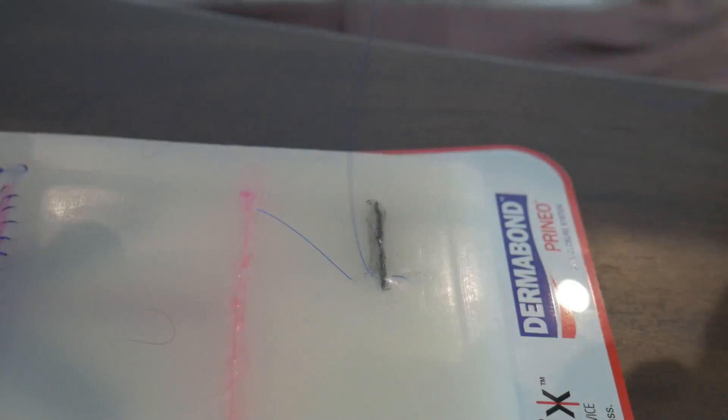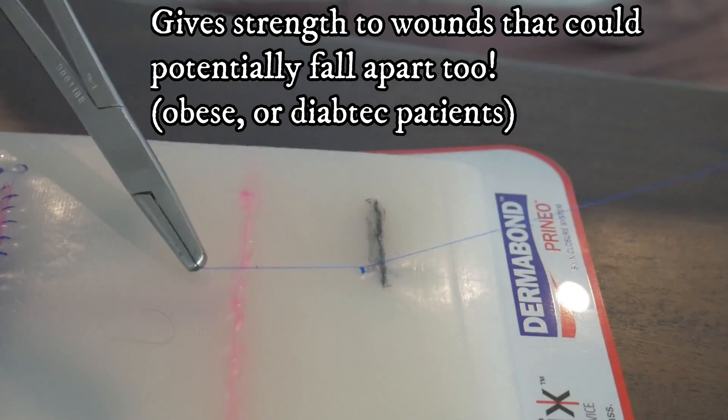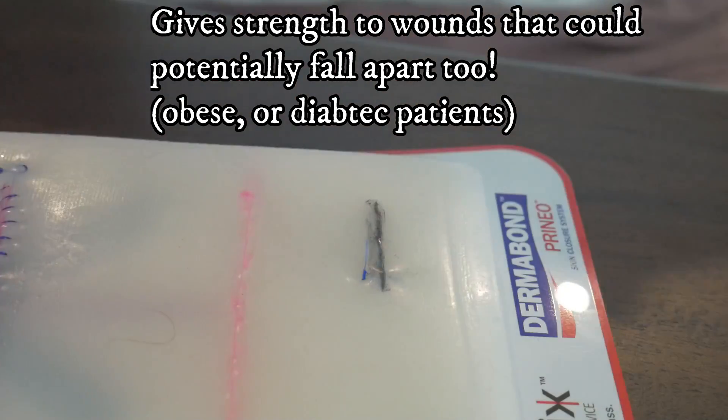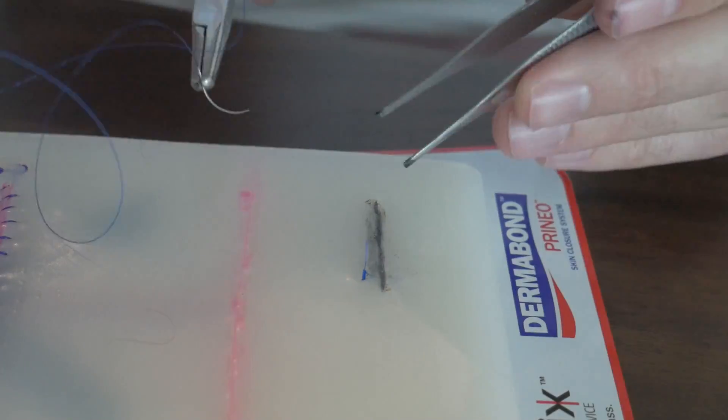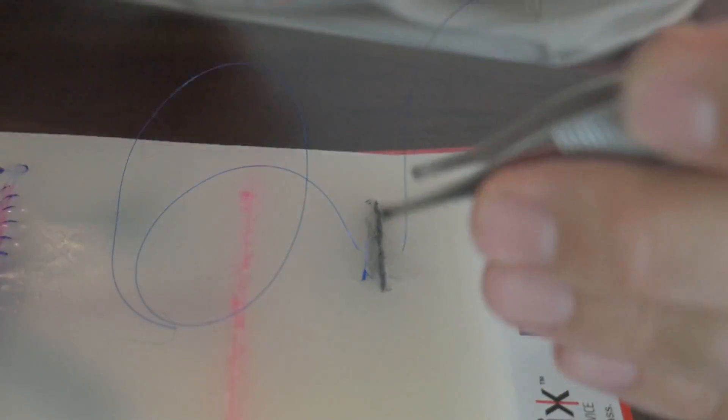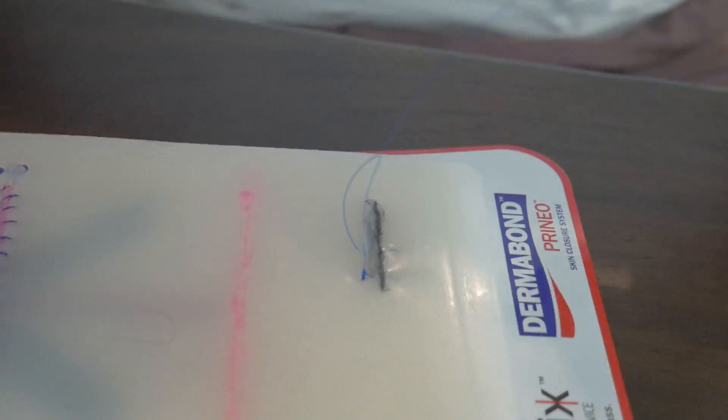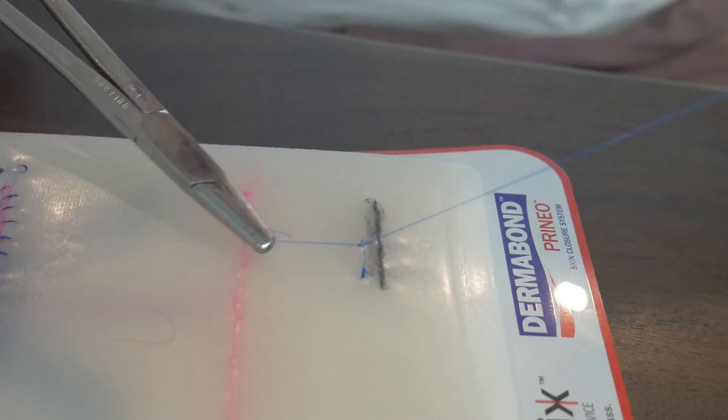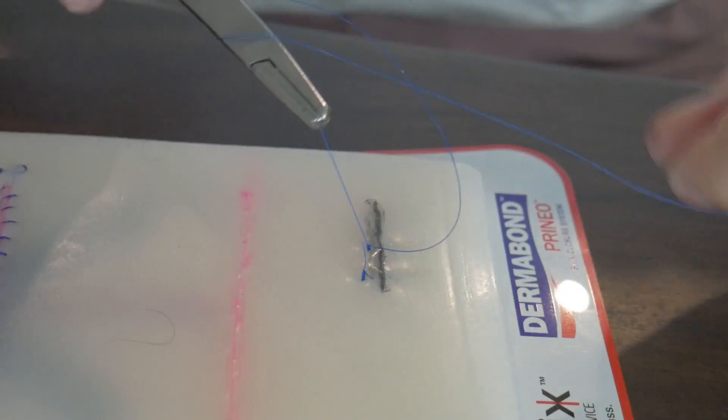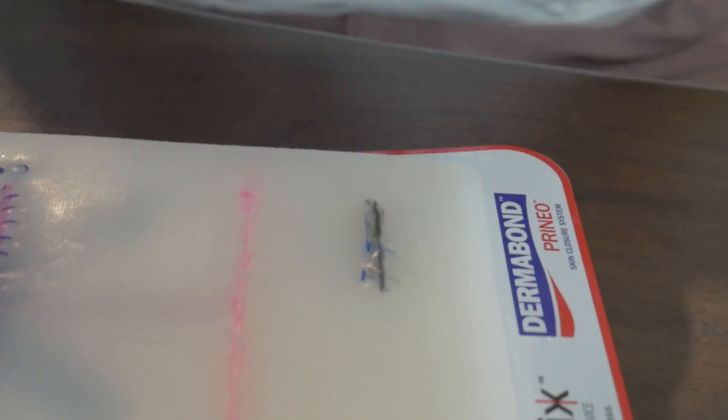What that's doing is it's grasping all of that tissue underneath the surface of the skin and it's just approximating that area. But not only that is it kind of everts the skin edges a little bit to help with wound healing on infected cases as well. As you'll see in this, as I close this up, I do three stitches on this wound. This is a pretty small cut. But they're spaced apart and you want them spaced apart because if it is an infected wound, you want it to drain a little bit. If it needs to drain, so you don't want the wound completely closed off 100%, you need it to still be able to drain.